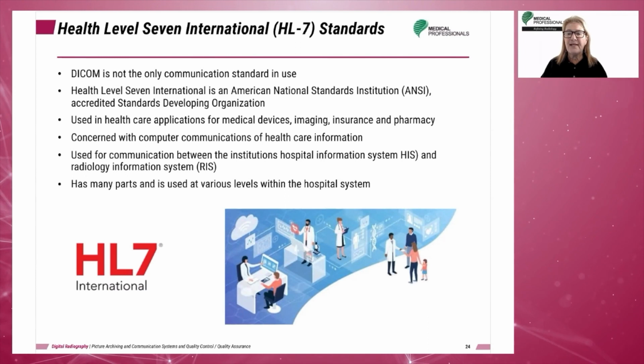The DICOM standard is not the only standard governing communication between various computer systems. Health Level 7 International is an ANSI standard developing organization. The stated purpose of HL7 standards is to provide standards for interoperability that improve care delivery, optimize workflow, reduce ambiguity, and enhance knowledge transfer among all our stakeholders.